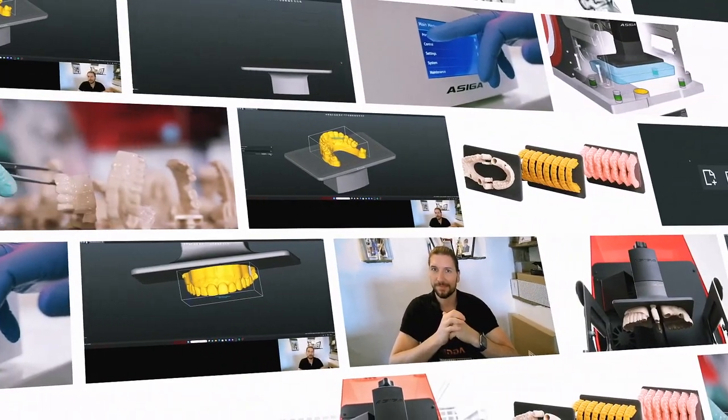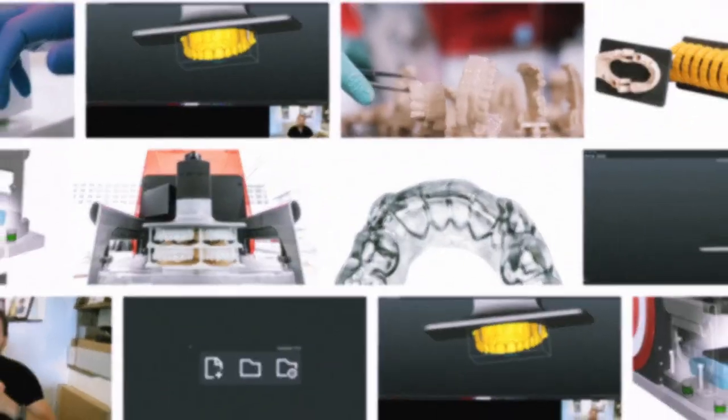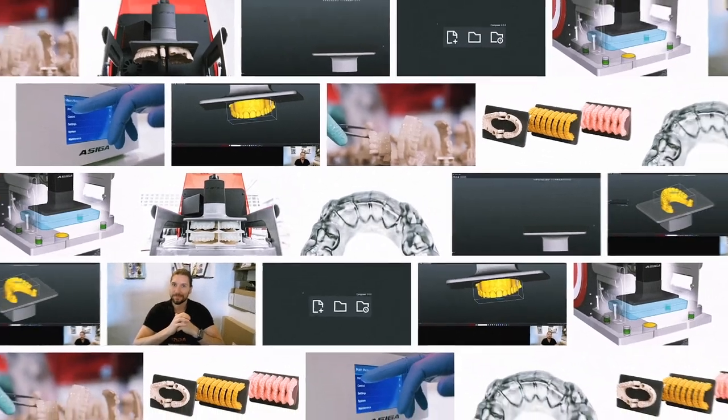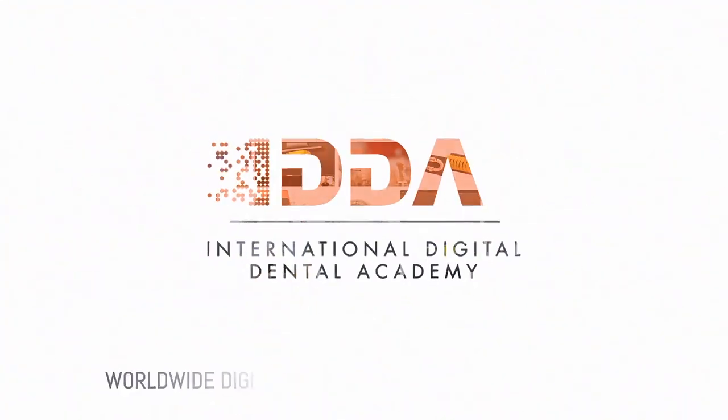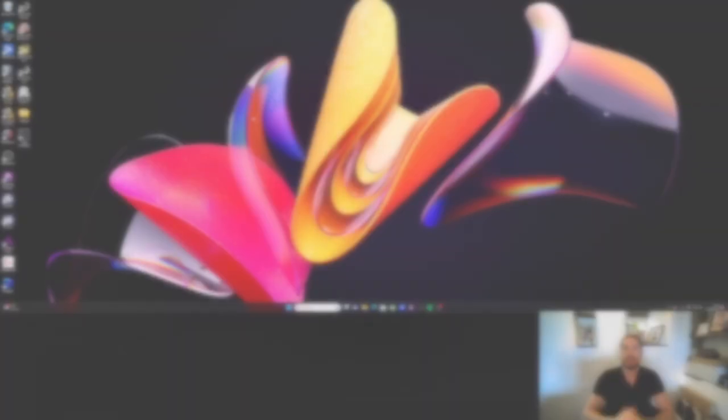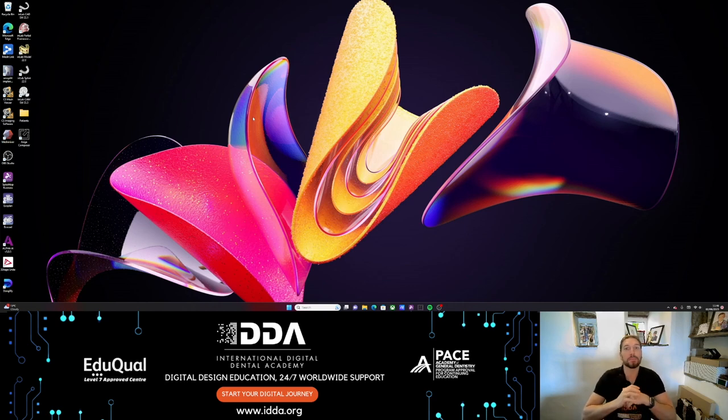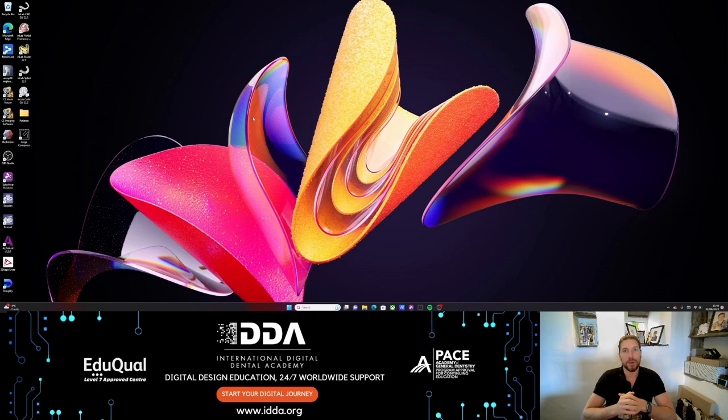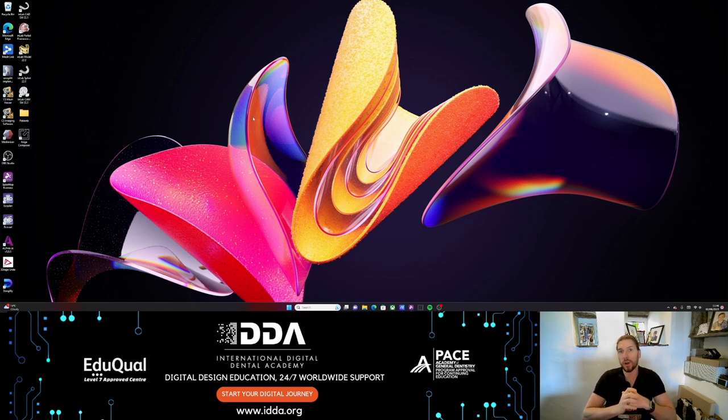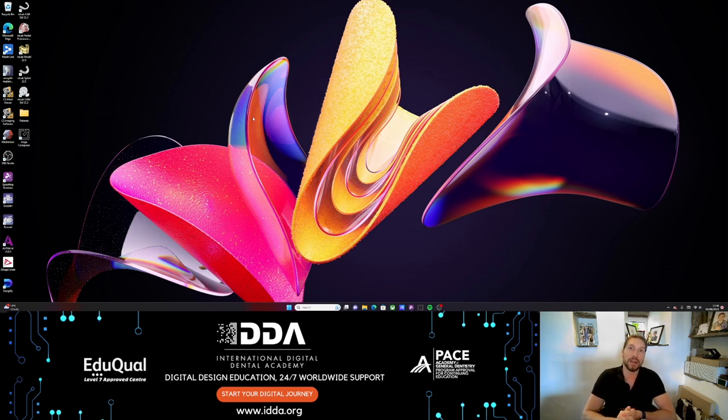Okay everybody, it's here, Asiga Composer 2.0. Let's have a look. Right everybody, so now we're going to have a look at the brand new composing software from Asiga. There's been a major overhaul of this slicing software.